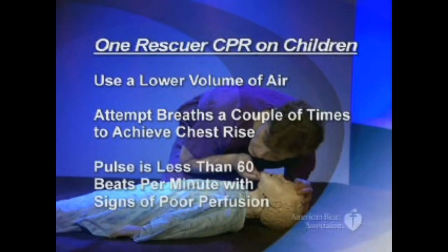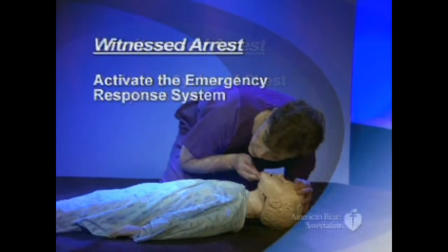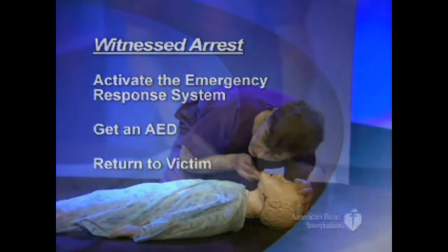If the child does not have a pulse or the pulse is less than 60 beats per minute, provide CPR starting with chest compressions. You should perform 5 cycles, about 2 minutes, of CPR before leaving the prepubescent victim to activate the emergency response system. However, if you are alone and witness a child collapse suddenly, activate the emergency response system and get an AED immediately. Then return to the victim to provide CPR and defibrillation as needed.